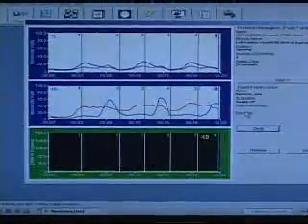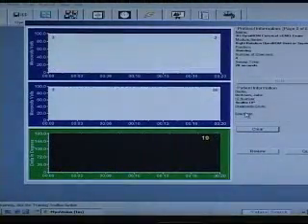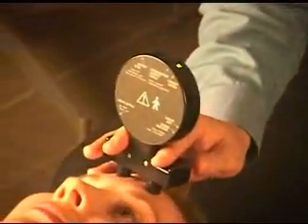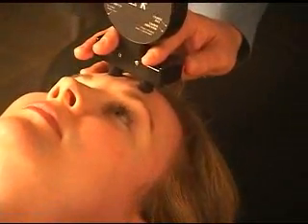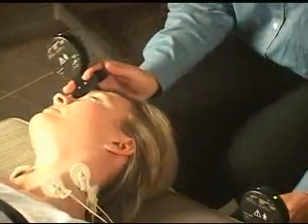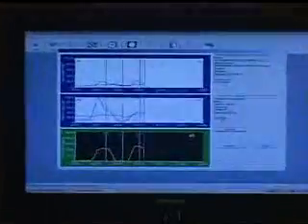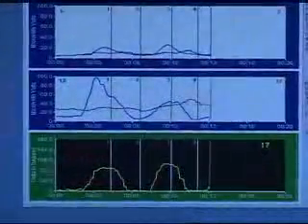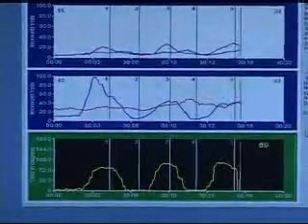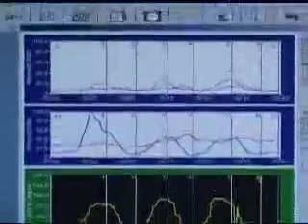So now you hold the button down again and you swap hands so that your right hand goes on top of the head, and we're going to measure right rotation. The other probe goes on the table and we press and release the button, go to the right, mark it by pressing the button, back to neutral, mark it by pressing and releasing the button. Back to neutral, mark it, go to the right, again we press and release the button, back to neutral, press and release the button, and then we're done.